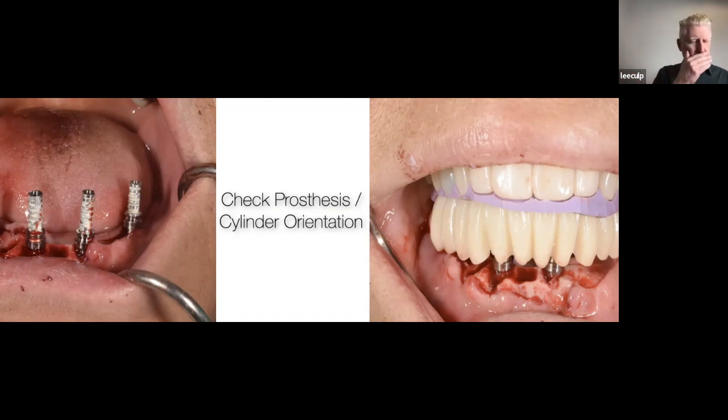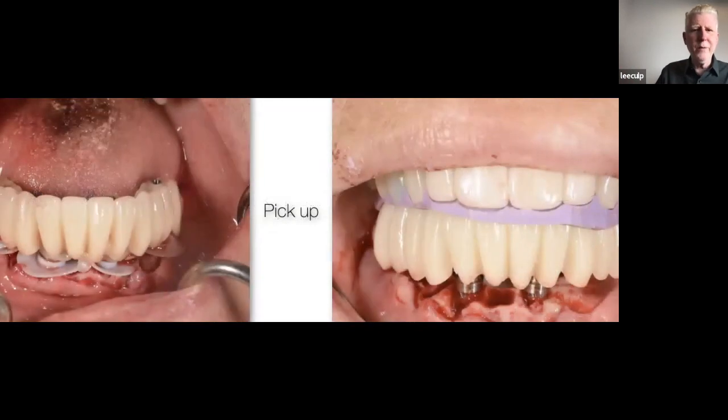So even though our implants are tilted and non-parallel, the abutments that we're correcting with at the right angles and the temporary cylinders all come out parallel again. So the restoration basically just goes over the top and drops. It doesn't always work out perfect like that, but this one actually worked really nice because I was there.